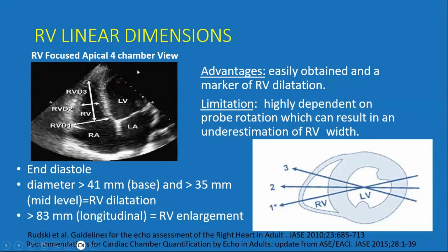Then these are the linear dimensions. This is a RV-focused view. All of us must learn in routine, in normal patients also, that we make a RV-focused view so that it comes in a routine. And when we have to measure these dimensions, we do not face difficulties.